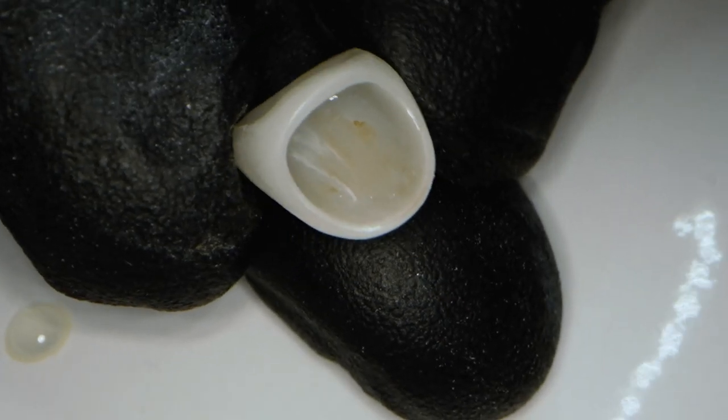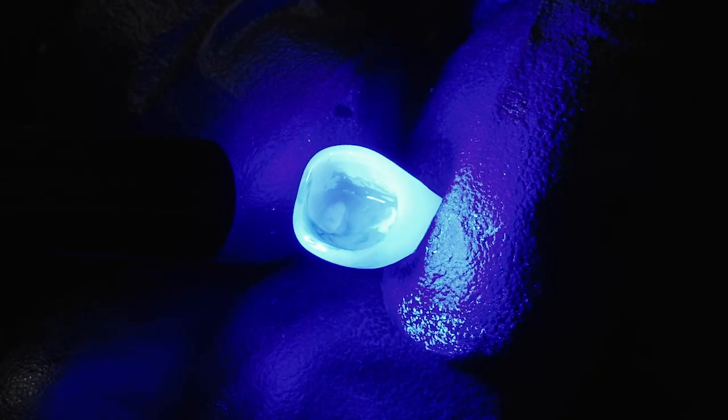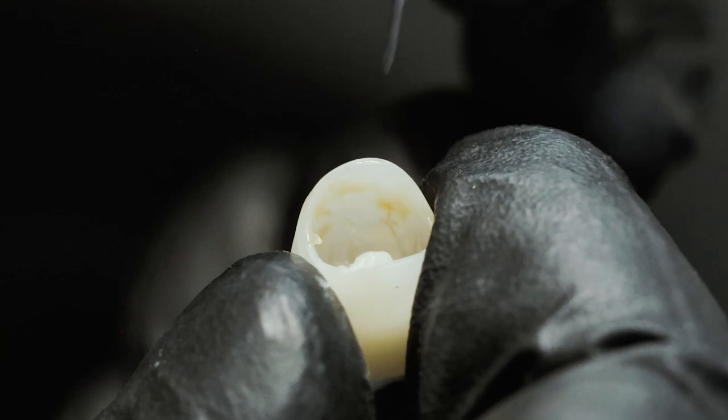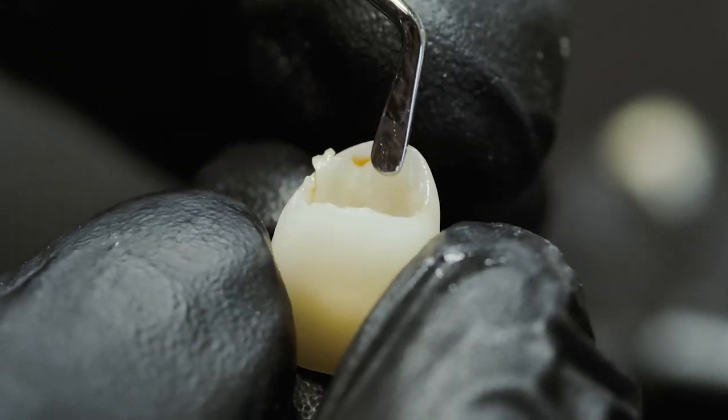I also add white spots or halo effects around the incisal margin, then light cure. I finally apply the cement I want to bond the restoration — in this case I use Edelweiss composite.